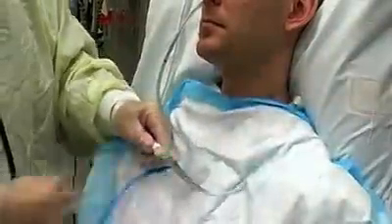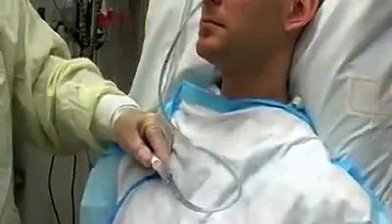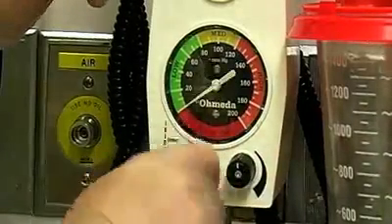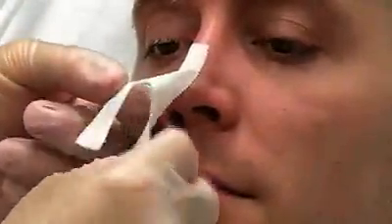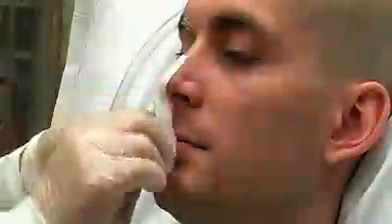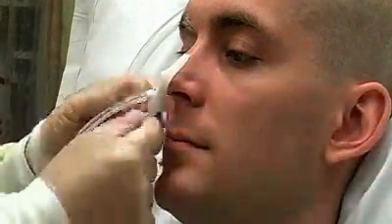After proper placement has been confirmed, attach the nasogastric tube to the suction tubing. Adjust the vacuum force to low or medium and set the control dial to the intermittent position. Finally, secure the tube to the patient's nose. First, attach a piece of adhesive tape that is ripped vertically for 1/2 of its length to the patient's nose. Then wrap the tails of the tape in opposite directions around the tube.